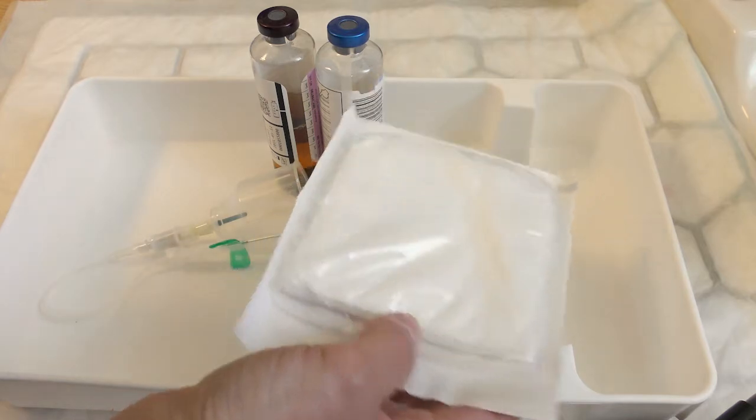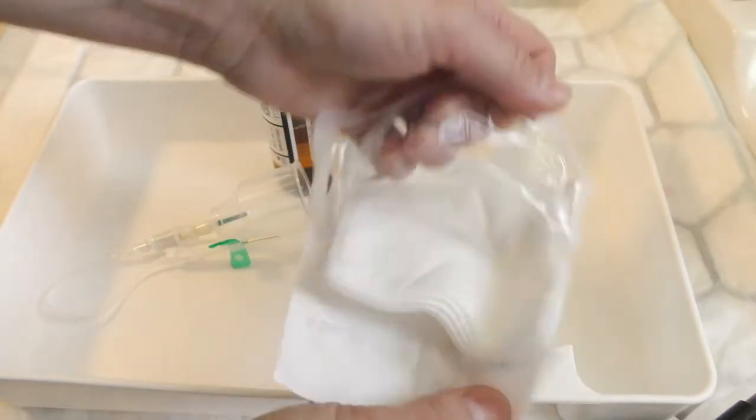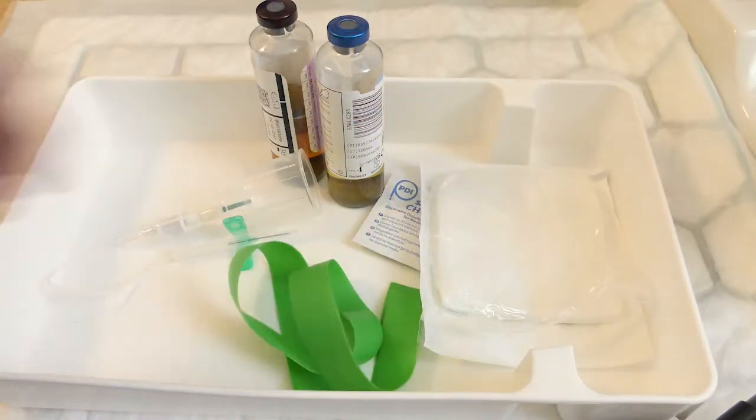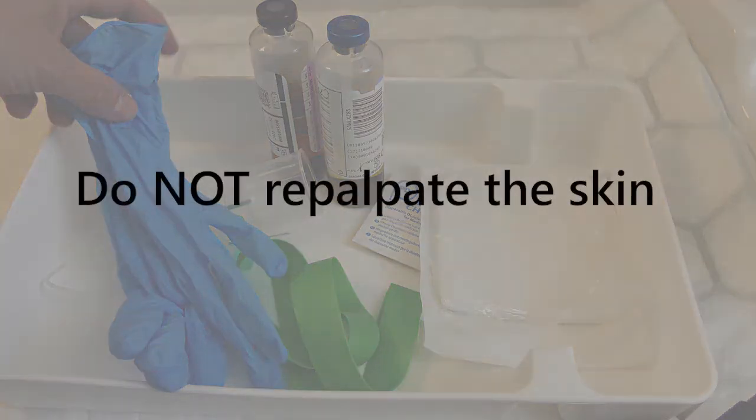A fresh pack of sterile gauze — carefully open the packet, leaving the sterile gauze inside the packaging to maintain sterility. A single use tourniquet and a pair of non-sterile gloves. The procedure is performed using an aseptic non-touch technique and the skin will not be repalpated again after cleaning.